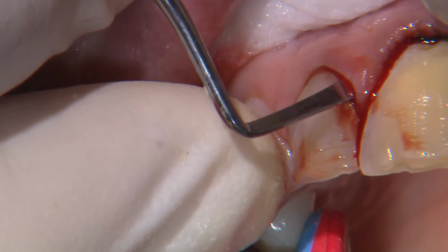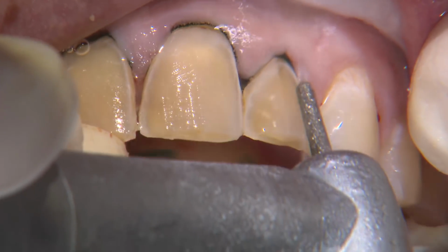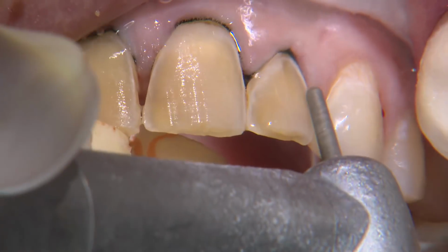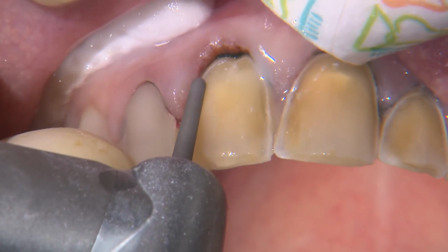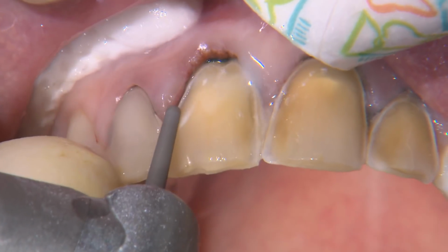The gingiva usually moves apically at least about 0.5 millimeter. This is really important for any anterior crown or veneer to not only avoid inadvertently damaging the soft tissue, but to also hide the restorative margins slightly subgingival once the gingiva rebounds. I position and refine the gingival margins only after the placement of the cord.